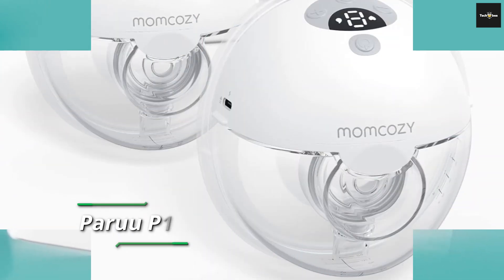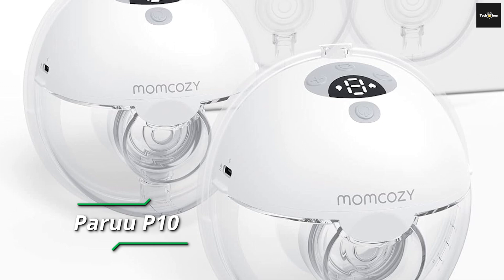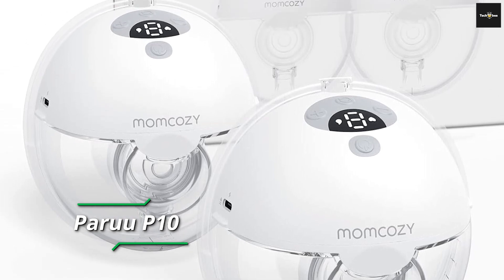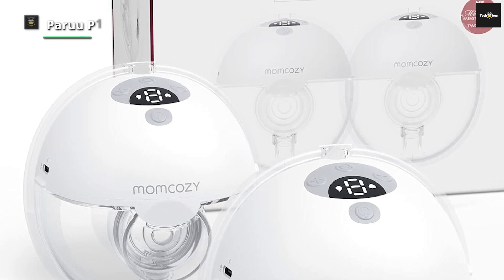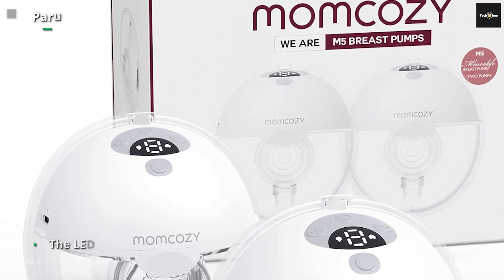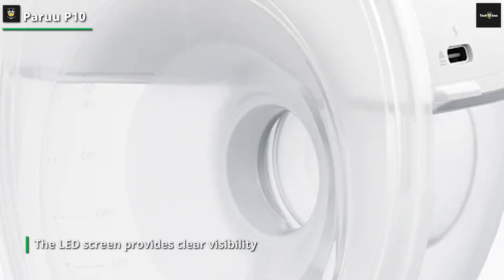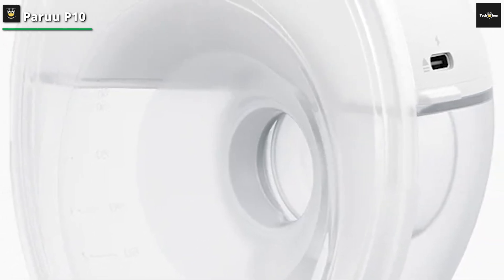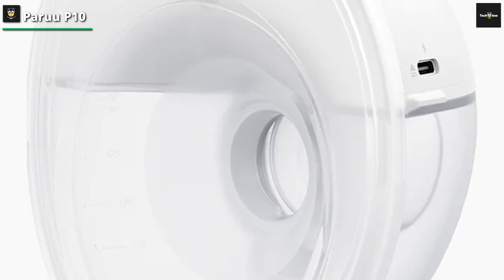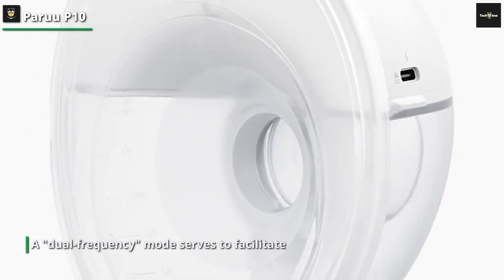PARU P10. The ensemble comprises flange inserts catering to sizes 19mm, 21mm, and 24mm, while the pump itself measures 28mm. Notably, mothers can determine their suitable flange size utilizing the measure card enclosed in the package. Featuring four distinctive modes and nine suction levels, this pump artfully emulates your little one's feeding process. The LED screen provides clear visibility of the suction mode, suction level, and battery status.